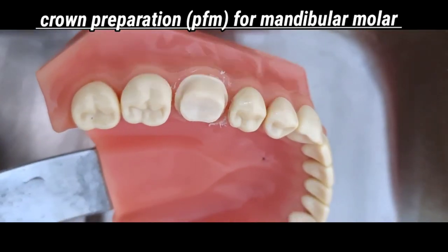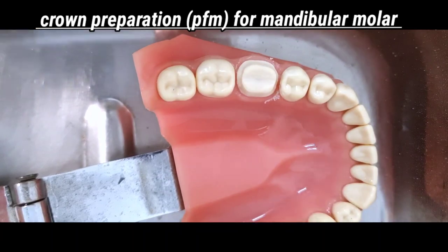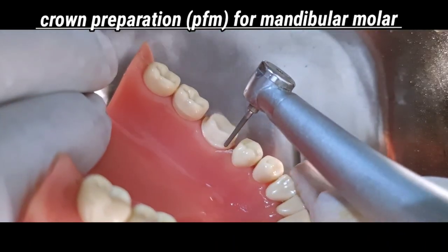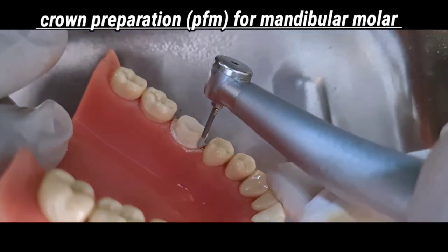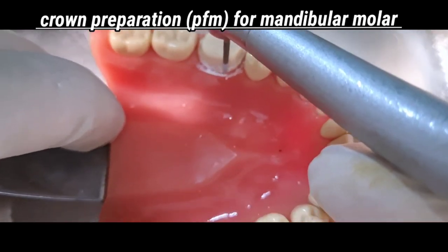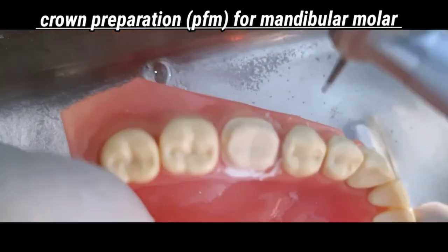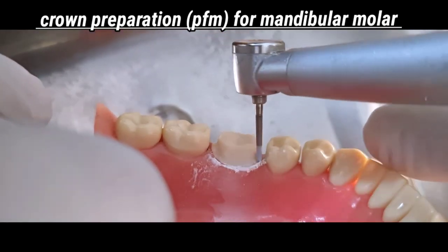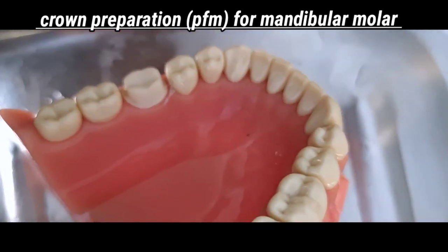The last step in tooth preparation is finishing and rounding off all the line angles, and the buccal margin can be lowered from supragingival to equigingival at this point with a finishing burr if it is needed. Mandibular posterior teeth have an inbuilt lingual inclination, and therefore a second plane reduction for the lingual axial wall is only achieved by rounding off the preparation along the occlusolingual junction. So rounding off all the line angles finishes the lingual margin of the preparation extending into the proximal margin, and the same burr can be used for finishing and giving a modified shoulder design to the marginal finish line. So a shoulder design to the marginal finish line with the help of a finishing burr.